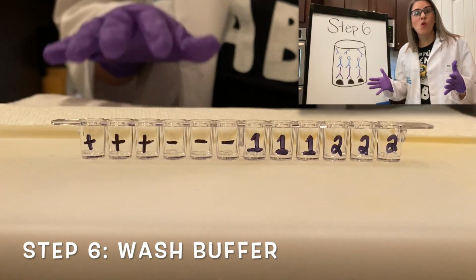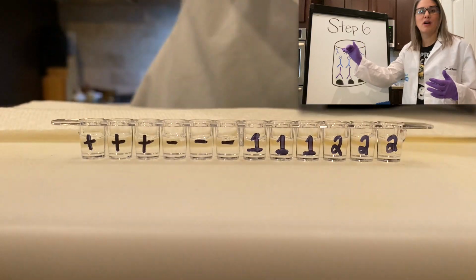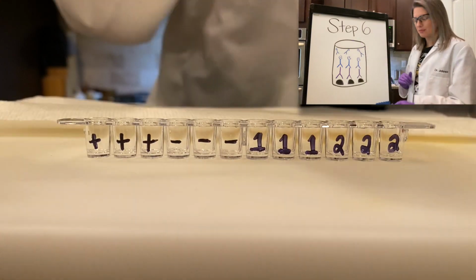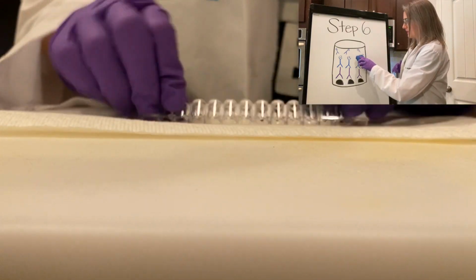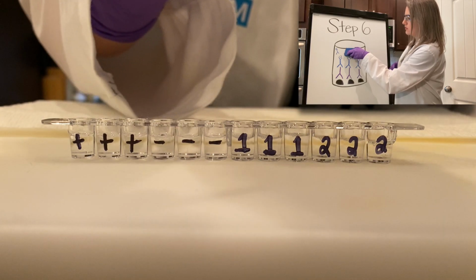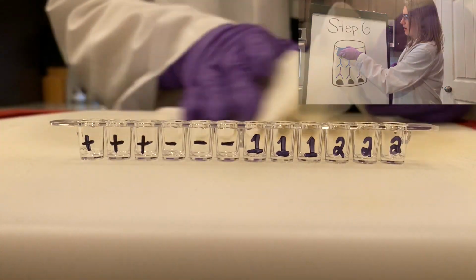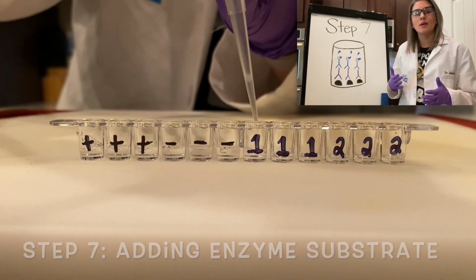Now it's the final wash step. Remember, we're using this to help get rid of any unbound molecules. So we've got a few of those enzyme-linked antibodies that aren't attached to anything. So when we add that wash buffer in, it's gonna come in and get rid of all of those unbound antibodies. For our final step, we're gonna add in our enzyme substrate.